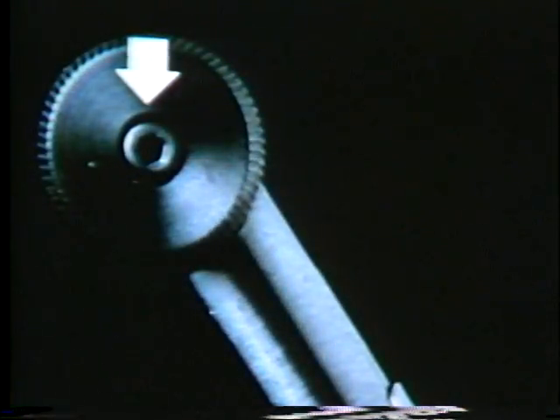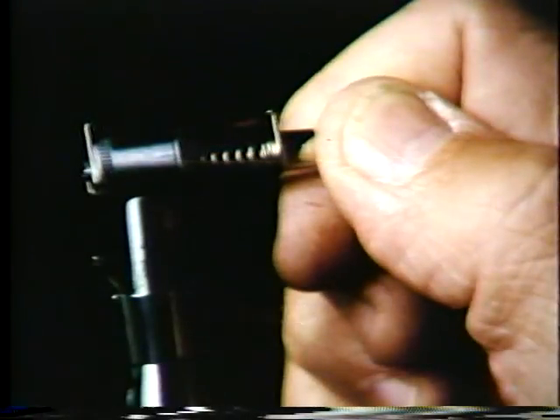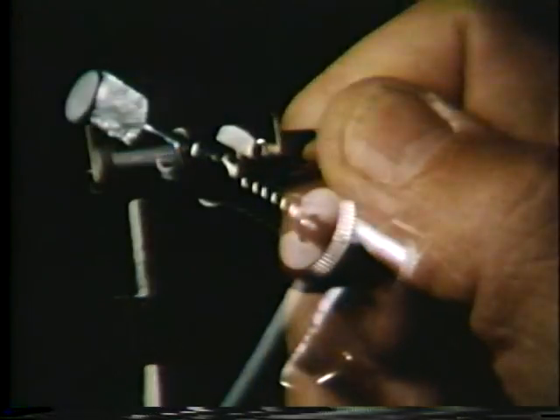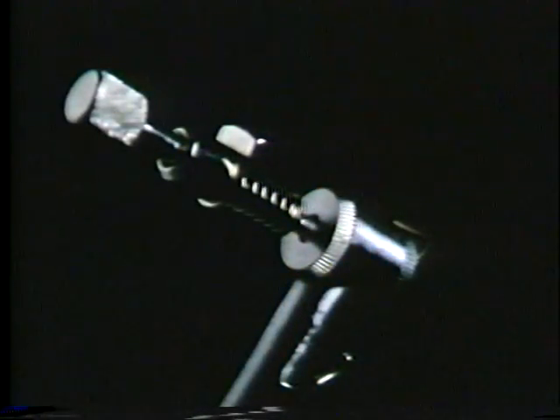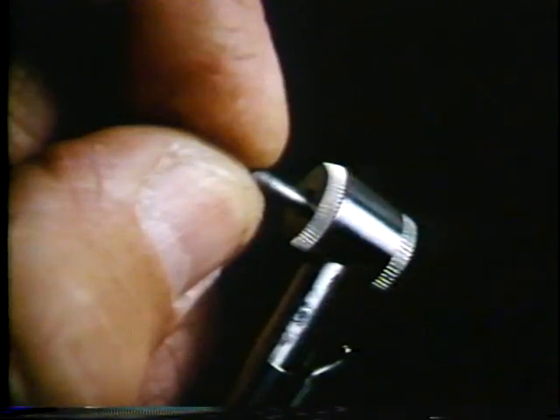The high-speed handpiece has a chuck to hold the burrs in place. While you are cleaning the handpieces at the end of the week, be sure to clean the chuck. Remove the chuck with a burr tool. Turn the tool counterclockwise until the back of the chuck can be seen at the end cap. Apply light pressure if the burr tool is hard to turn. Remove the burr tool and keep turning the chuck with your fingers until the chuck comes out.